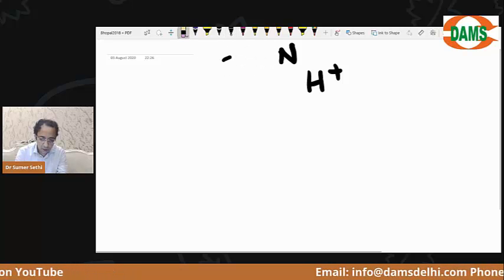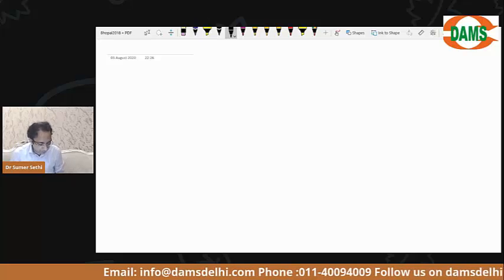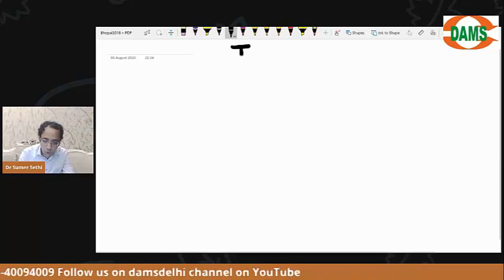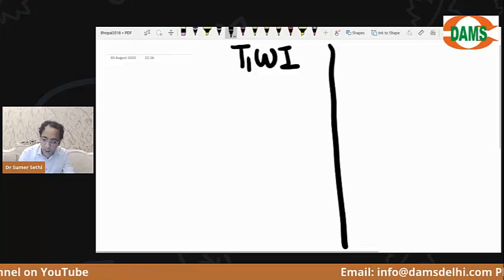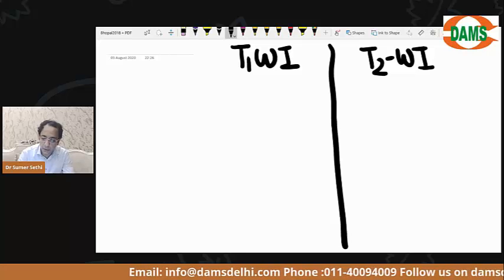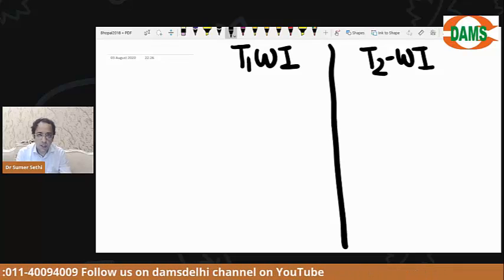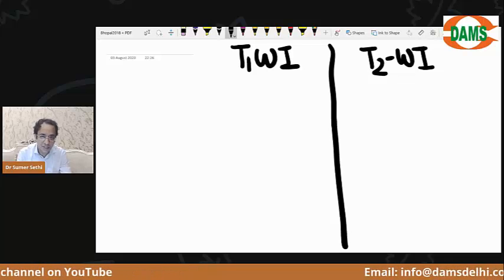Now see, listen to me and answer. Let's see if you can answer. Listen to me and answer, beta. So clinically, all we need to know is that in MRI we have two basic types of images, called the T1 weighted image and the T2 weighted image. Listen to me, beta. It's early in the morning, it's okay. Don't worry, you're relaxed.